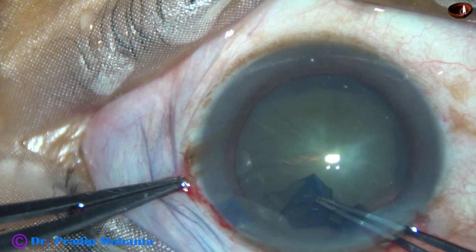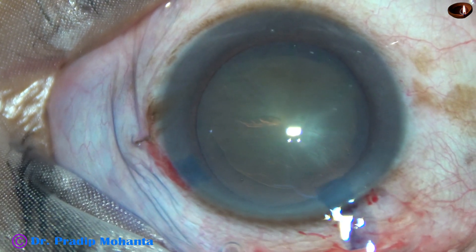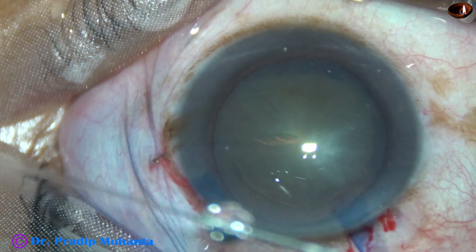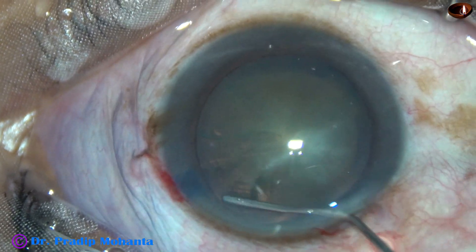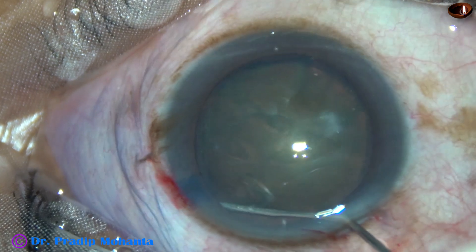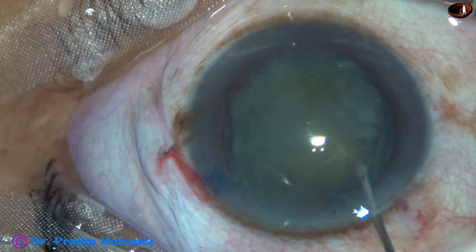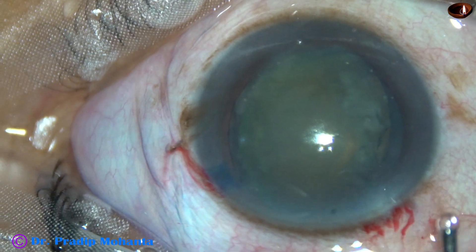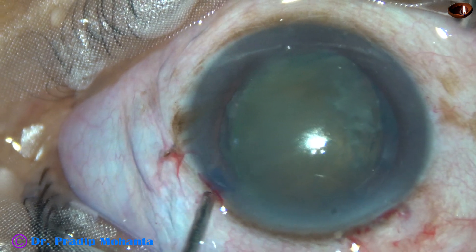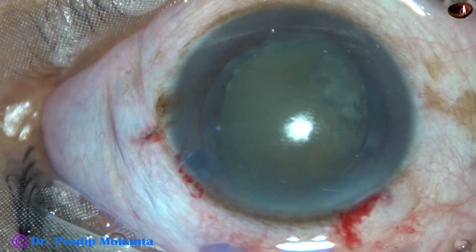For this technique we need a rhexis of a little larger than 5.5 mm. Now by hydrodissection, the cataractous lens is tilted. Fluid is injected slowly and steadily, and one part of the equator prolapses out of the capsular bag — the lens stands out and tilts.